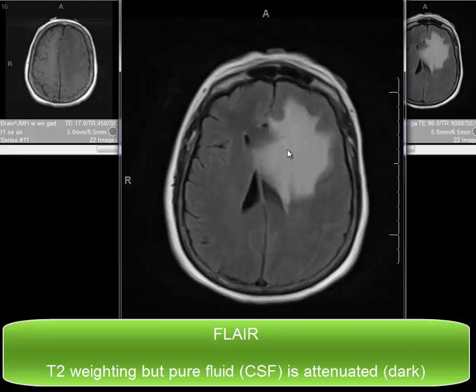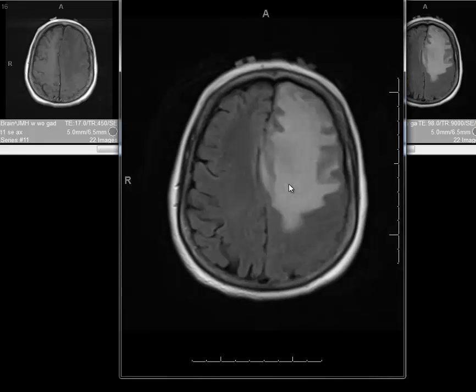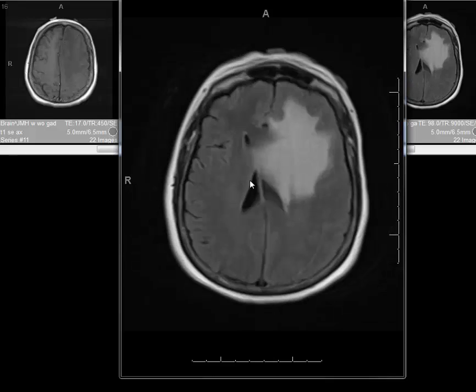However, it has T2-weighted information, with edema showing up as very high signal on the FLAIR images. This sequence provides a better contrast range with more conspicuous delineation of pathology, and is especially good for looking at lesions in the periventricular region.